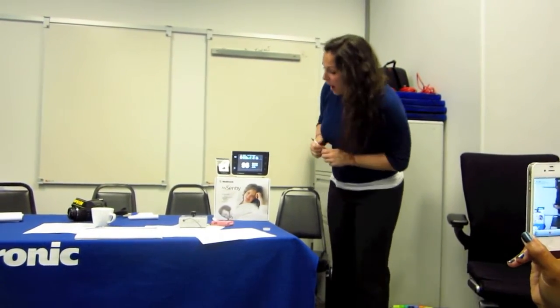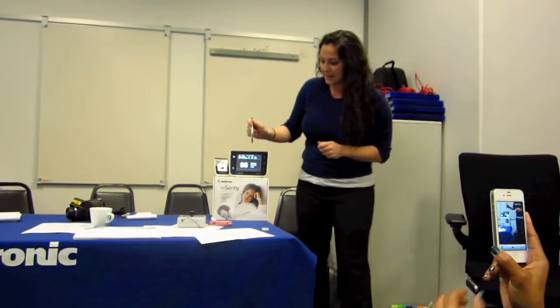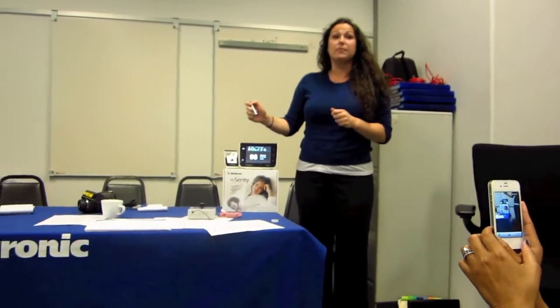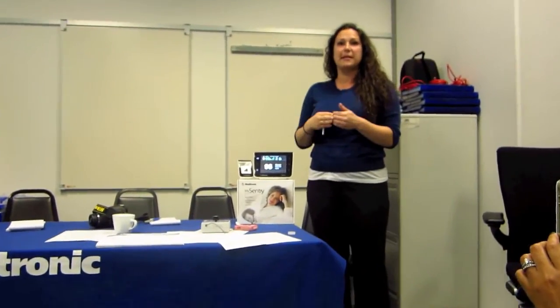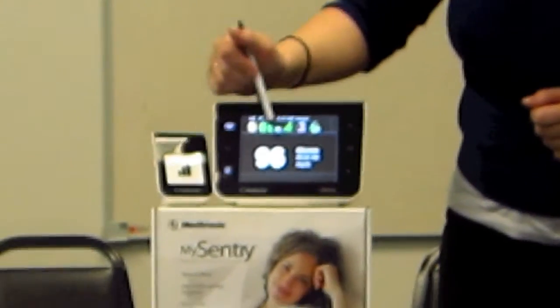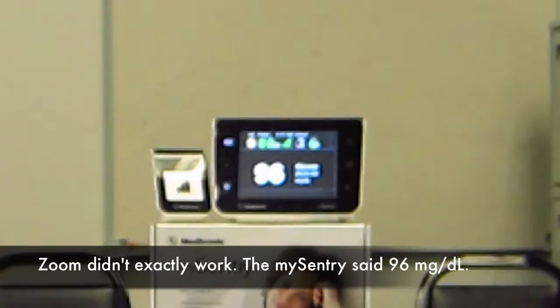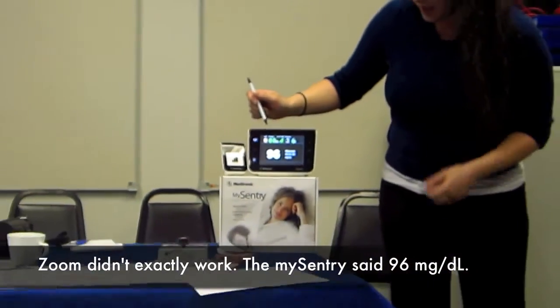the monitor. So as you can see, this is the home screen that we're currently on right now, and what that does is display the sensor glucose value. Using the sensor is really important with the mySentry because that's how you're going to get the most value, being able to see those sensor glucose readings, as you guys are all aware. So this will show your sensor glucose, and that's transmitted every 5 to 7 minutes as it's being read by the sensor. And so that's transmitted to the monitor.